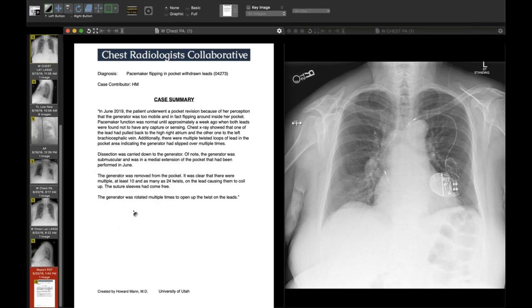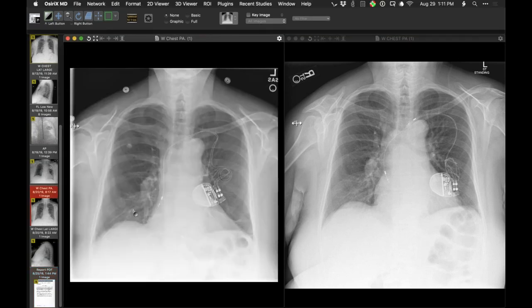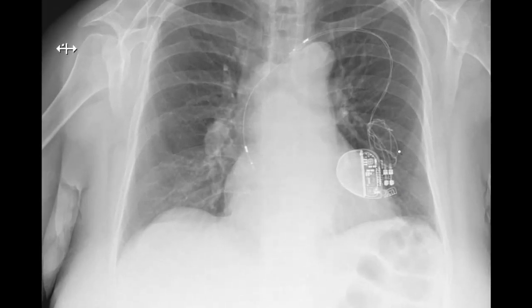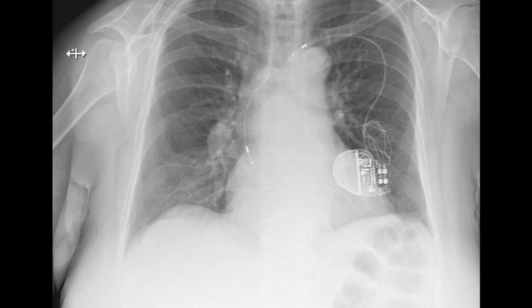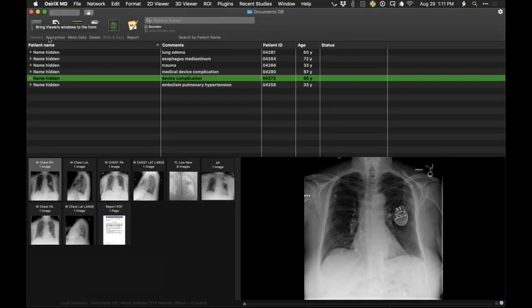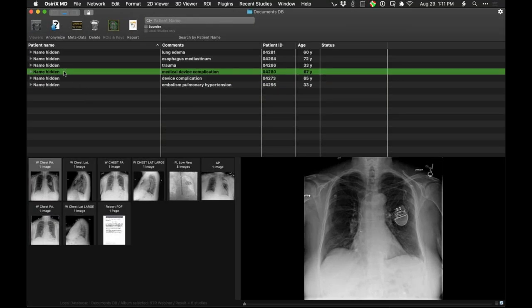This is the image after it was fixed and more secure again. A colleague mentioned one patient who was an active swimmer, and they thought repeated arm motion was causing it to continue to twist rather than just twiddling with it. It's interesting how this one coiled up in that fashion, twisted up around itself. I won't call this a classic Twiddler syndrome, but certainly the capacious pocket and moving around is the mechanism.